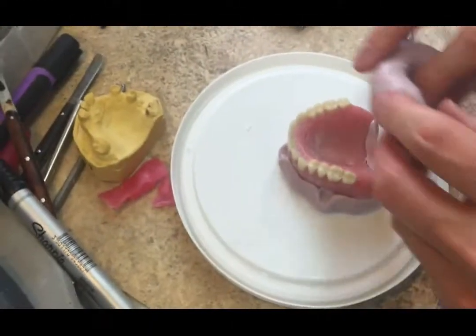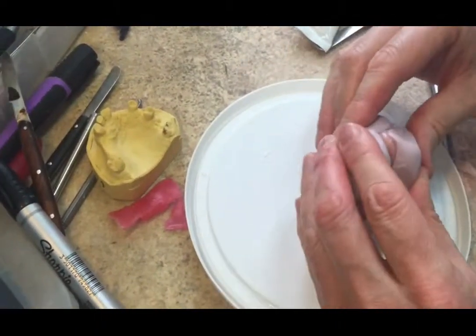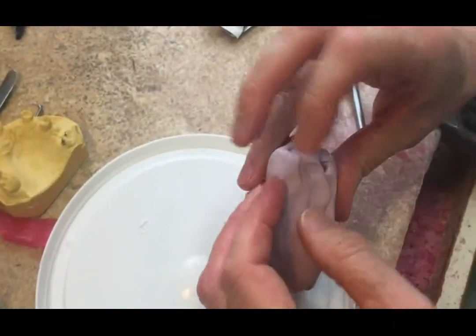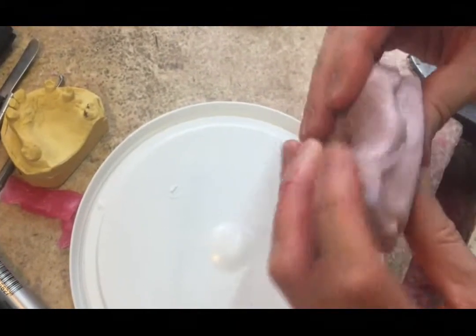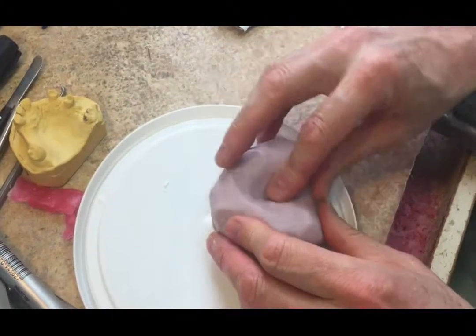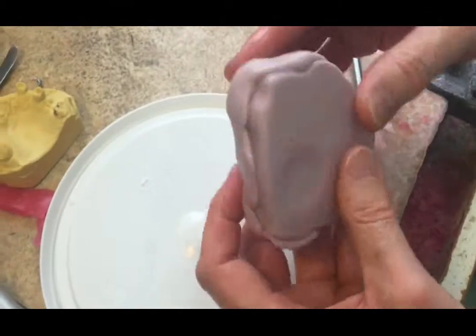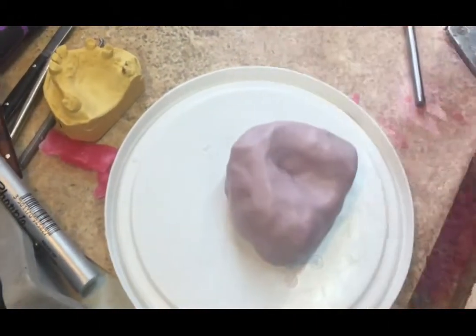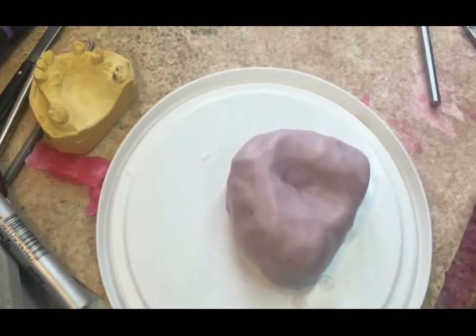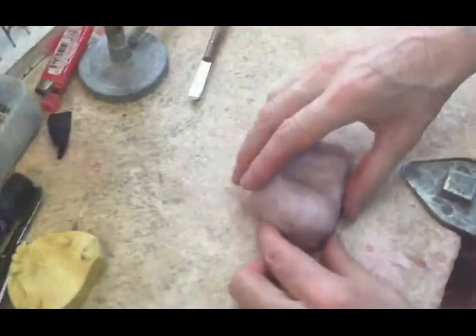Now we've mixed up our second half of the putty and we're putting it in so we won't get any bubbles or drag from pushing the putty around. We're manipulating it over the denture and down onto the keys we've made, forming a complete encasement of the denture. Bear in mind, if you don't use enough putty the mold will be too weak — it has to be strong and stable so it doesn't flex. We now have it fully encased with two separate halves: the top half replicating the teeth and acrylic part of the denture, and the bottom half replicating the fitting surface.